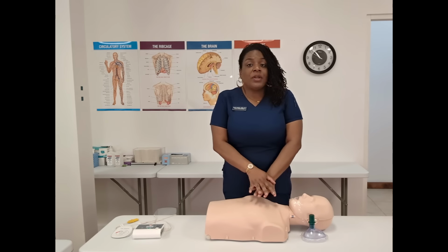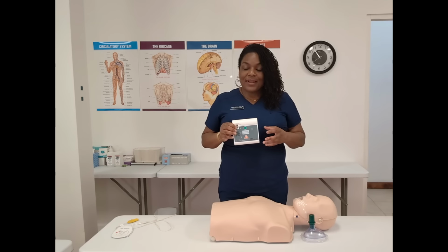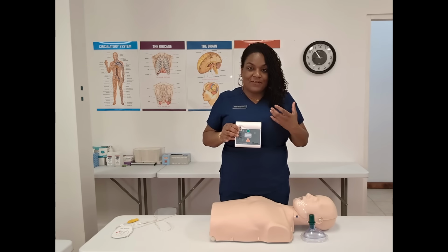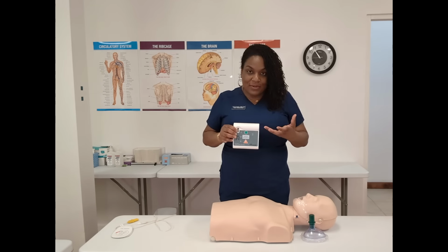And now we have our AED. The AED stands for Automated External Defibrillator. The reason why we say external is because some patients will have implanted defibrillators or pacemakers. And you'll know that because you'll see an elevated area beneath their skin.